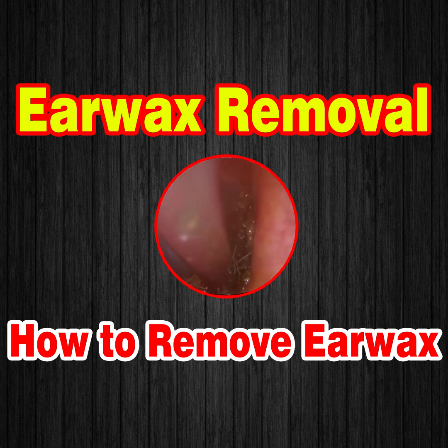So it's still a bit tricky. Come back into the anterior recess, because I've curled the end of the fine end as well, just to make sure that you avoid contact with the bone. You don't want to be touching that bone, it would be very uncomfortable for the patient. And I suspect probably that's what's happened to the patient in the past, especially as we saw making contact with side walls. Just freed it out from there, so again it was quite a struggle, but we managed.